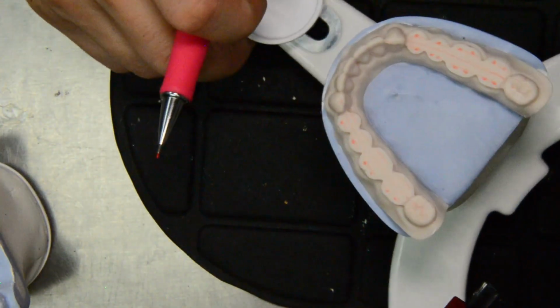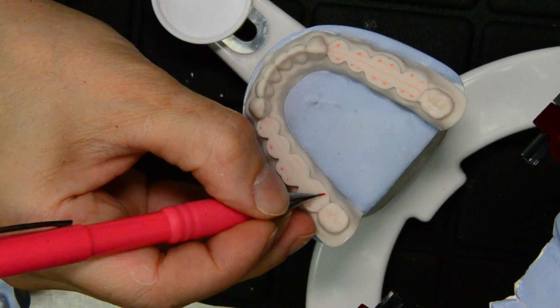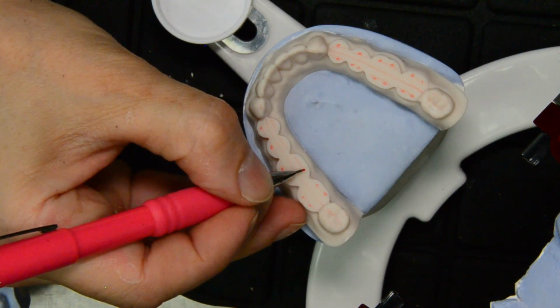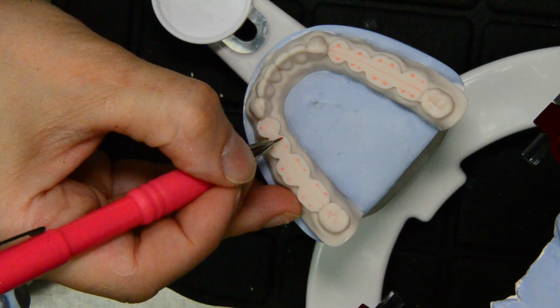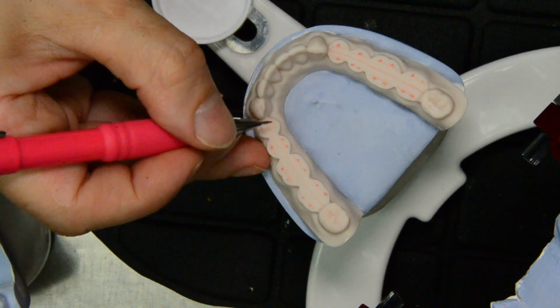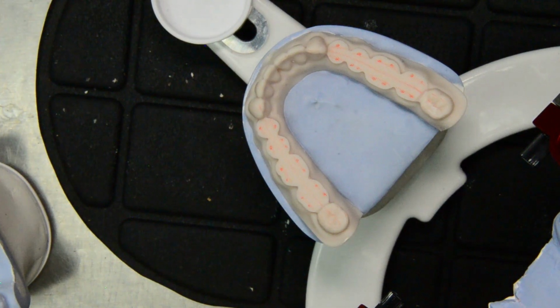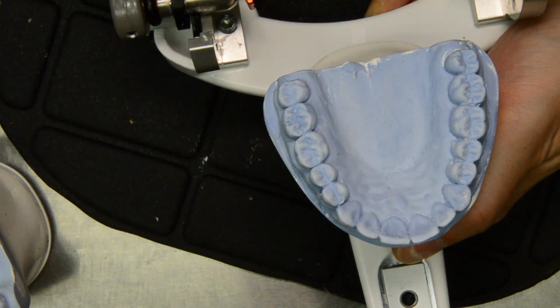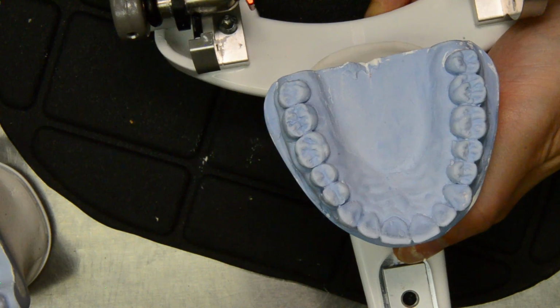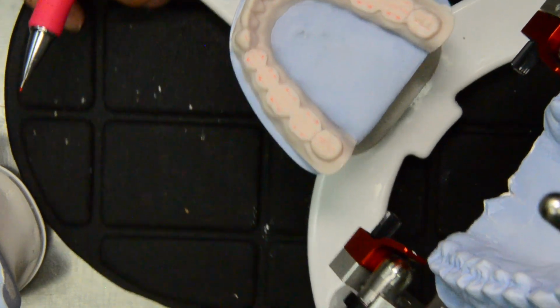So we're going to do the same thing here. We're going to mark the linguals just about evenly on the line. And remember, these lines are basically just to get us started. At a later point we can move these a little bit depending on how our upper fossas line up. Remember that we're going to have to do one side cusp to marginal ridge and the other side cusp to fossa.